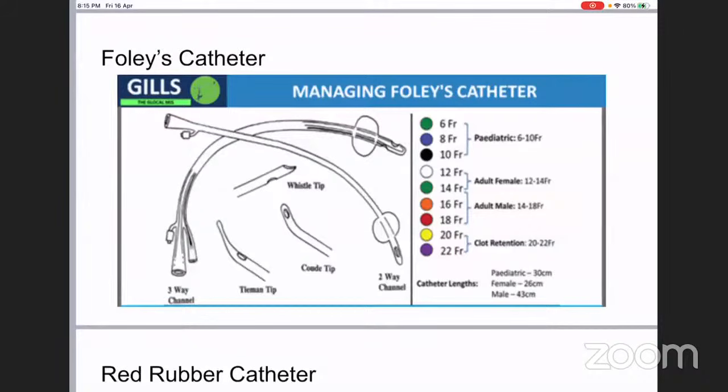Okay. So then they will ask you the steps of catheterization. Always remember that catheterization, or any other sort of invasive instrumentation, has to be performed with all sterile aseptic precautions. You first take consent of the patient, expose the patient properly with adequate privacy, and then paint and drape the area. If you are catheterizing a male patient, after painting you use 3 swabs. You first clean the perineum, then the foreskin, then you retract the foreskin and clean the glans with the sterile solution.